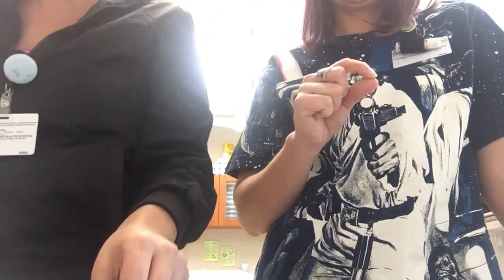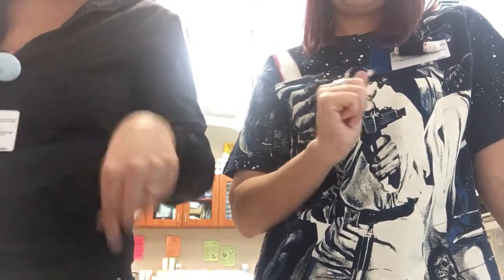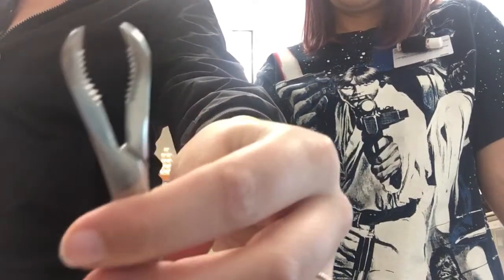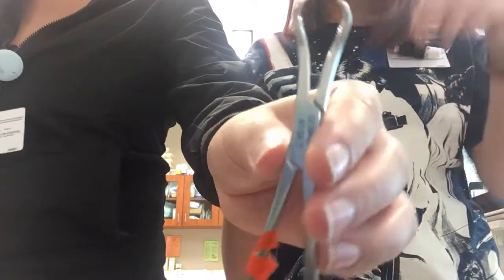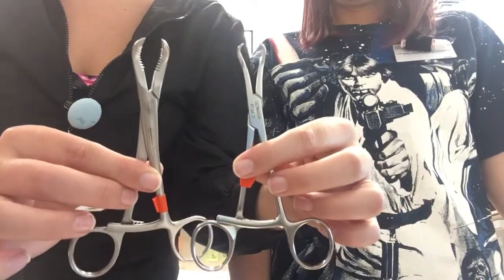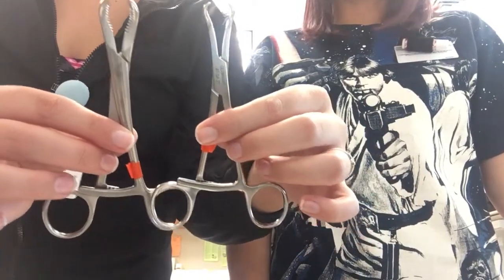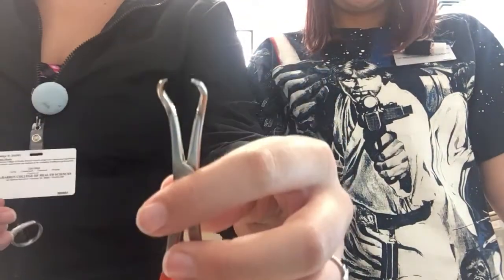Remember that the periosteum is what's on the outside of the bone. And then lobster claws — it literally looks like lobster claws. And this one is a pointed reduction. It's pointed, and since they're kind of similar it's like a smaller version of the lobster claws — a smaller reduction — and it's pointy, so: pointed reduction.